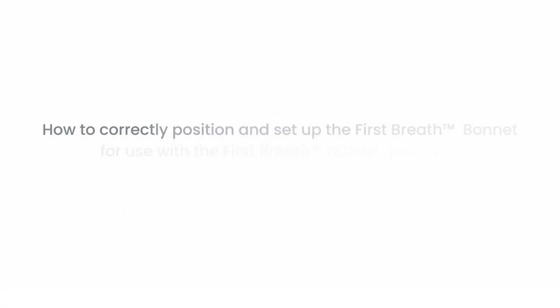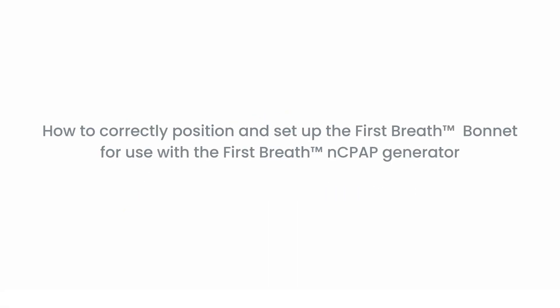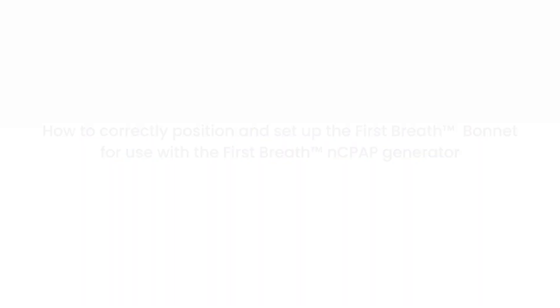This video shows how to correctly position and set up the First Breath bonnet for use with the First Breath NCPAP generator.